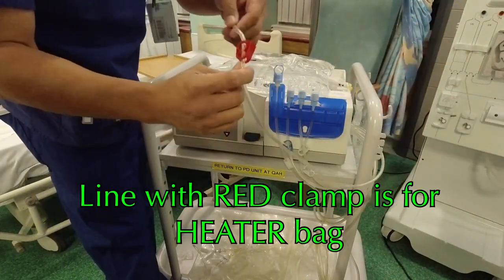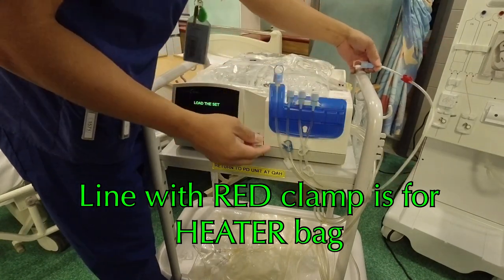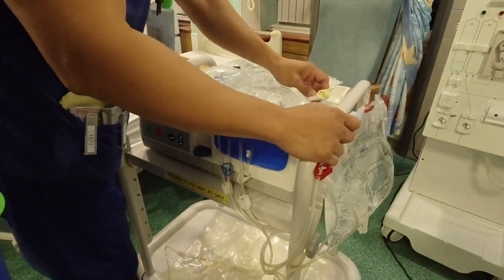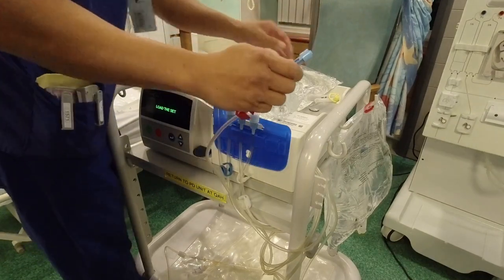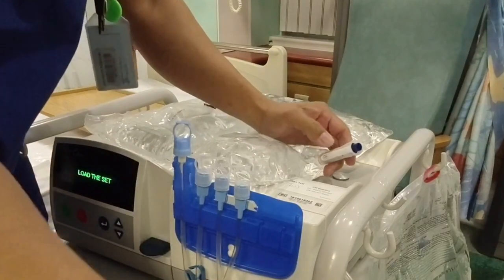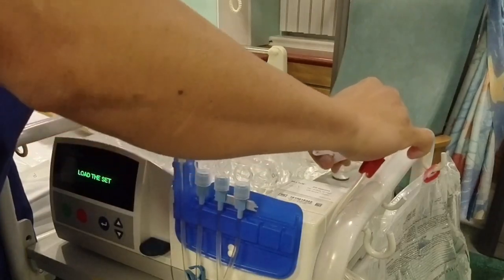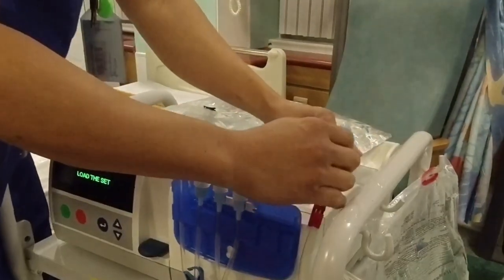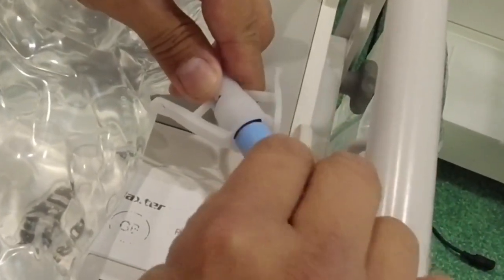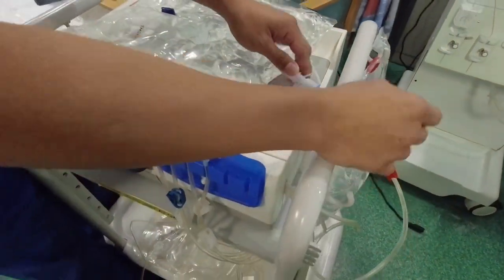So the red one is, remember, red hot. So that goes onto your heating. Yeah, so red is hot. Okay, just to move it closer so you can see. So you take this seal off. All right, and then you connect it there. Twist it. Okay. And just leave it hanging for now.